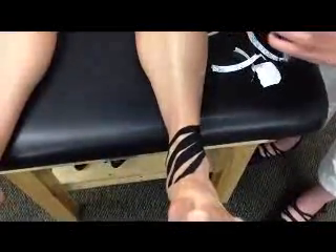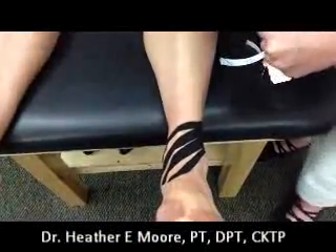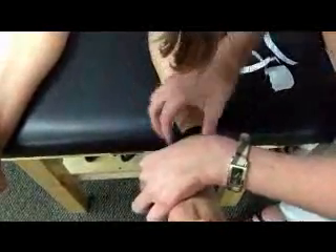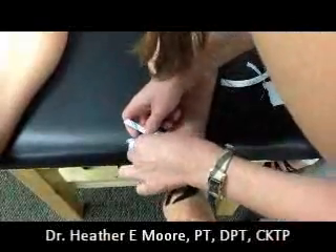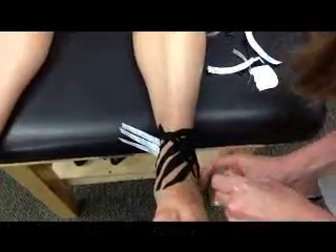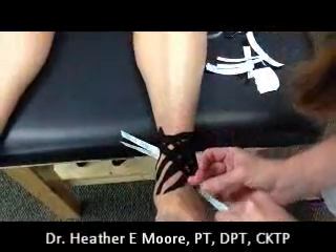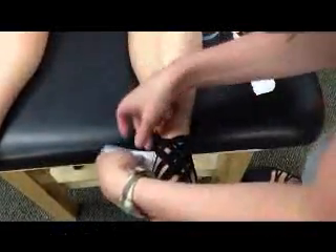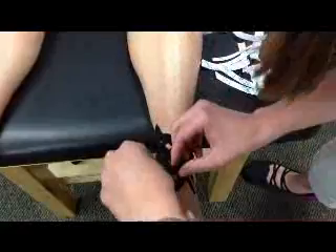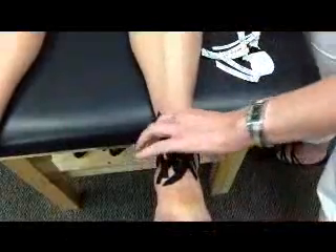Then you're going to take your second fan strip and go right above the other malleolus — in this case the medial one. Rub that down with no tension. And then again, take your finger-like projections and lay them down with little to no tension.